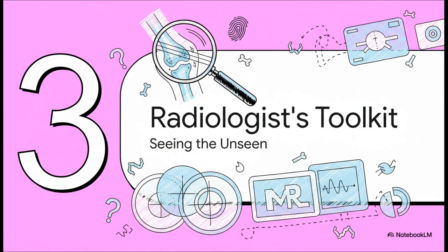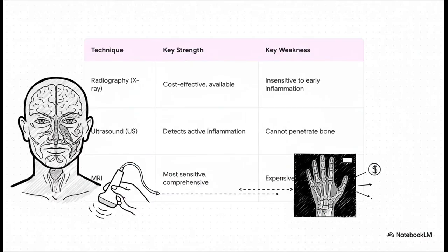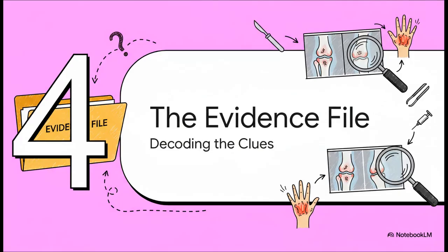So you might be wondering, how can we possibly see all this chaos happening deep inside someone's body? Well, this is where our radiologists come in. Think of them as the detectives with the high-tech gadgets able to peer inside and gather the evidence of this internal fight. Here are the main tools in their toolkit. You've got MRI, which is the gold standard. It sees everything, soft tissue, bone, you name it. Then there's ultrasound, which is amazing for spotting active inflammation as it's happening. But you know what? The classic X-ray is still a huge player. It's cheap, it's everywhere, and it is fantastic for seeing the long-term structural damage, the bone erosion, which is a dead giveaway for RA.